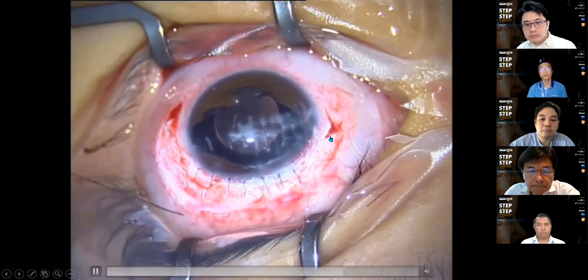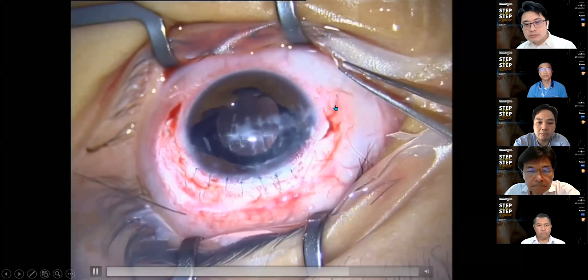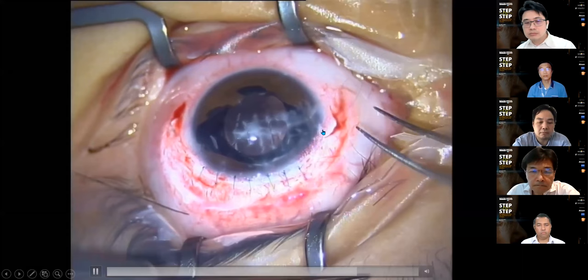One thing I want to stress here, when you tie a knot to a loop, make sure that you pull both sides of the loop. I mean, both sides. If you notice, I don't really hold it, I just loop around it, so that on both sides you get a firm knot. Otherwise, your knot will be loose because you're not sure which one will be tightened. And then you repeat the same thing.